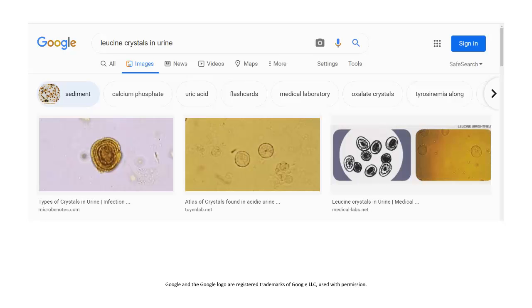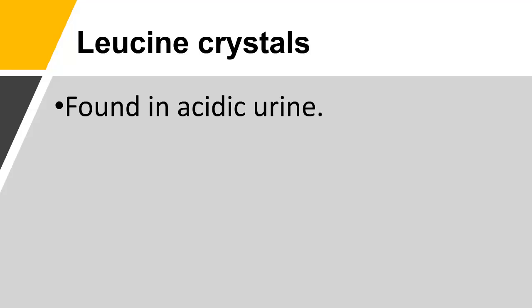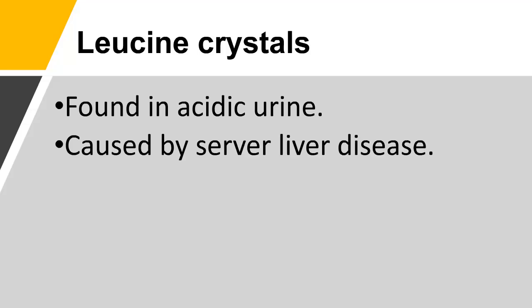Leucine crystals in urine are found in acidic urine and are caused by severe liver disease.